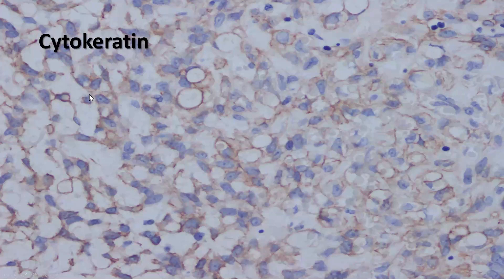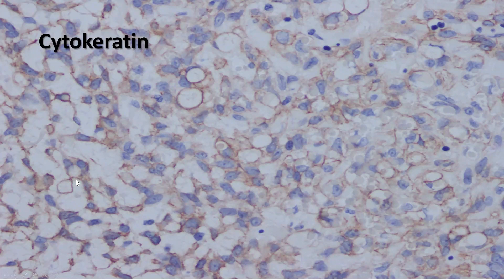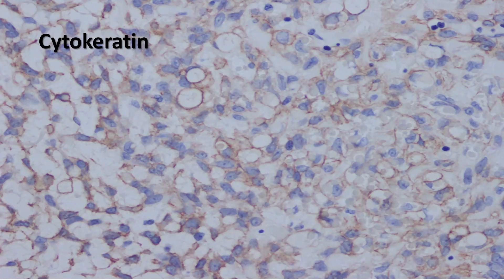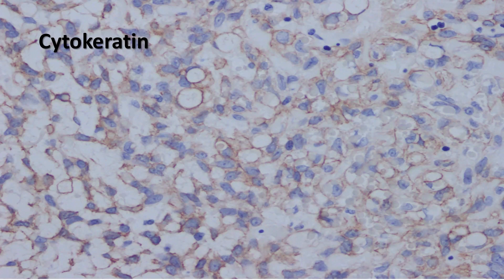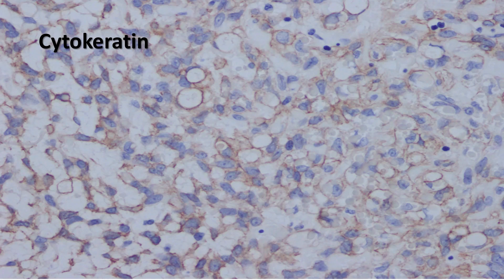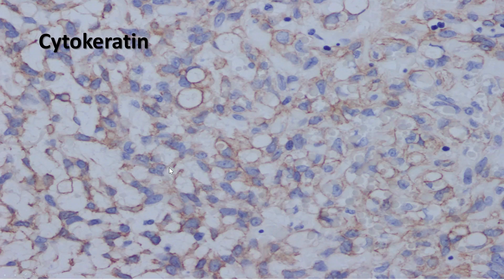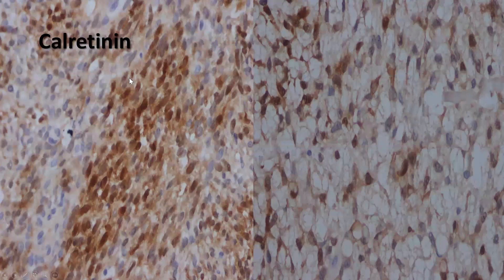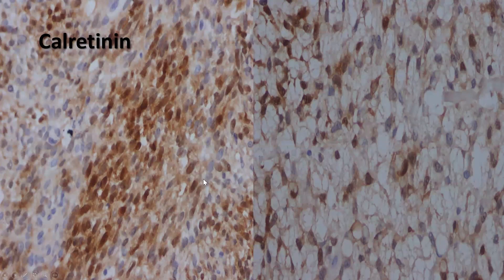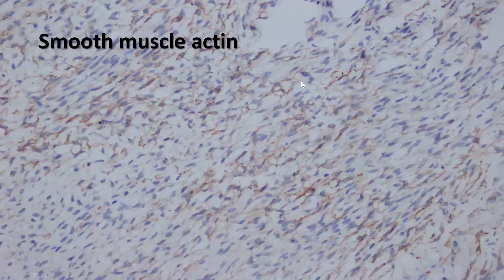Cytokeratin is typically positive — and this is the pitfall — cytokeratin would be positive in the signet cells, and this is where confusion might arise with the differential diagnosis of metastatic signet ring carcinoma of the stomach or, for example, from the appendix. In contrast to those tumors, this particular tumor is EMA negative. So we have to perform both cytokeratin and EMA in order to rule out metastatic signet ring carcinoma from the stomach or other sites. The tumor cells show very characteristic clear positivity in the signet ring area.